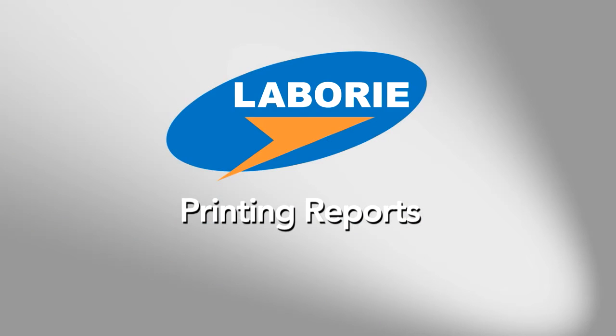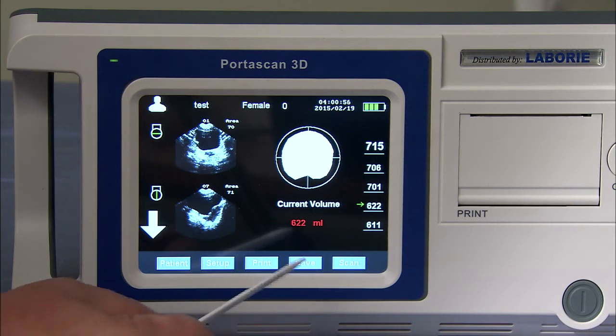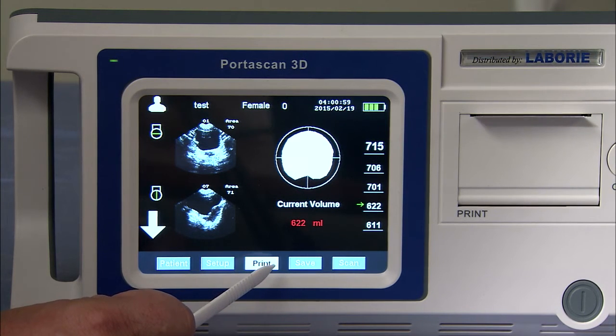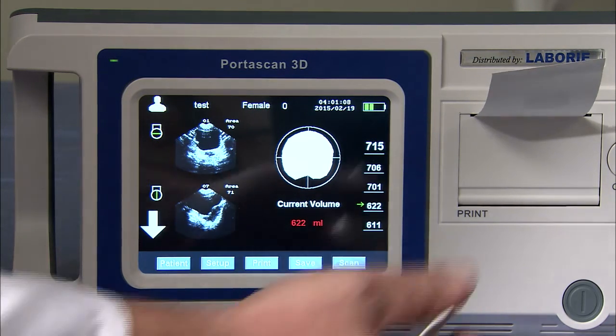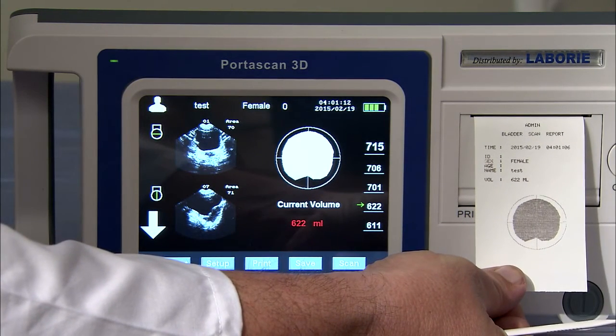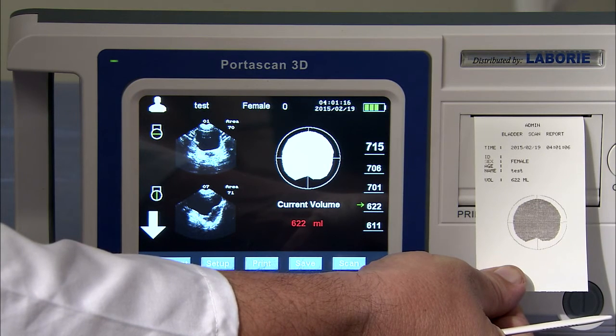Now that we have finished scanning the patient, we are able to print the scan on the internal thermal printer. By going to the bottom of the screen, simply click on the print button and the thermal printer will start to generate a report. Once the report is generated, you will see an image of the scan along with the patient data, time, and date.